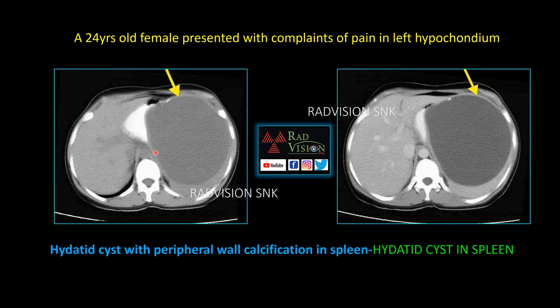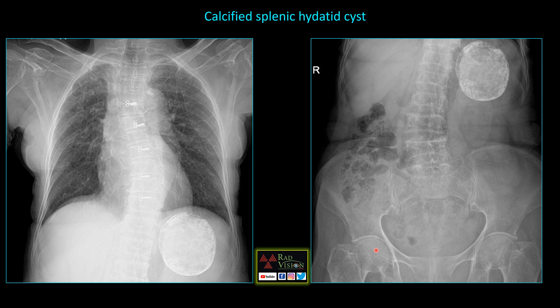Next case: a 24-year-old female presented with complaints of left hypochondrium pain. You can see there is a large cystic lesion noted in the spleen with eccentric rim calcification, and the cystic lesion shows peripheral rim enhancement. This is a hydatid cyst in the spleen. In the next case, you can clearly see a calcified lesion noted in the spleen — this is a completely calcified splenic hydatid cyst.